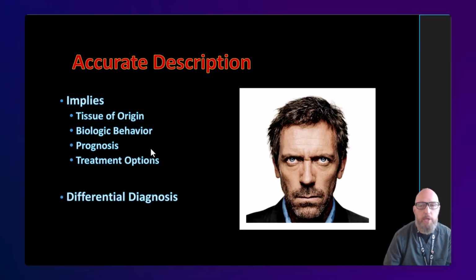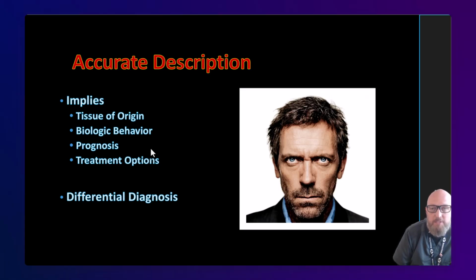And pay attention to the location of the lesion. That's a big one. That's also the thing I see sometimes experienced dentists ignoring the most. Location tells you the potential tissue of origin, which tells you the type of lesion it might be. We'll spend a whole part on location because it matters that much.